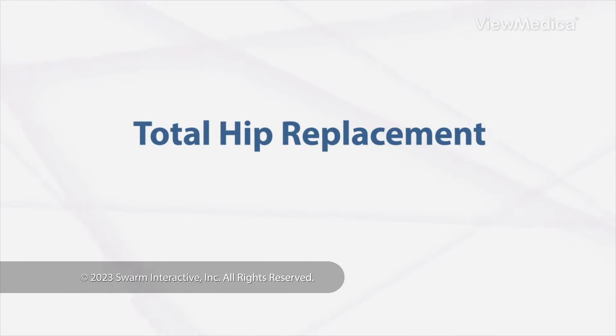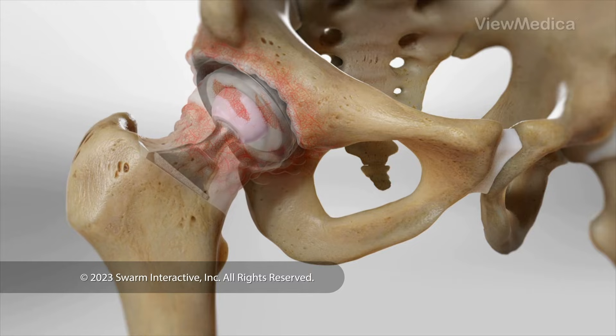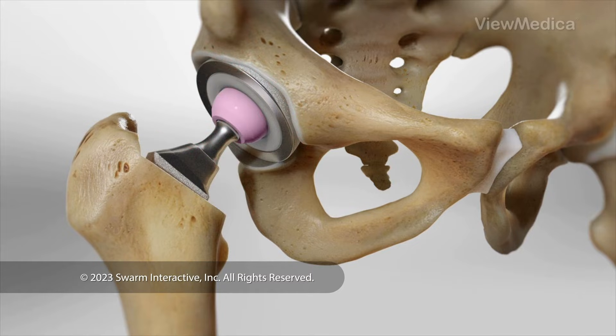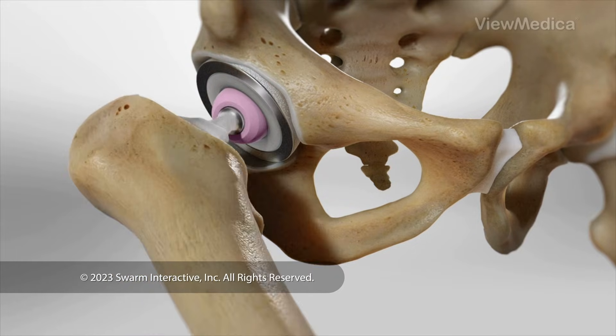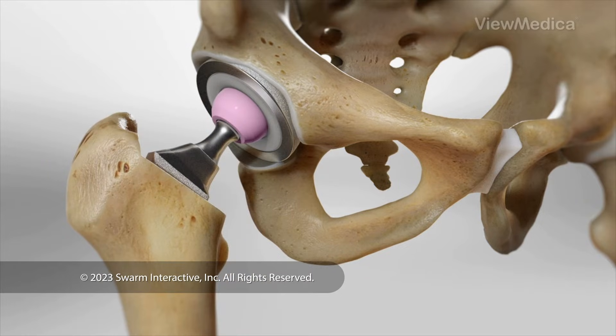Total Hip Replacement. This surgery replaces your damaged hip joint with implants that move like the ball and socket of a healthy hip. A total hip replacement can restore your hip function and reduce your pain.